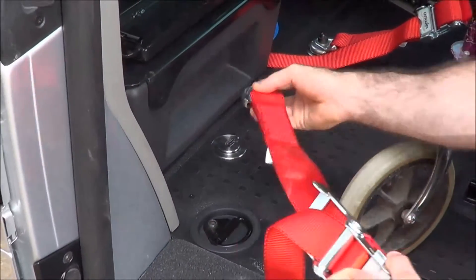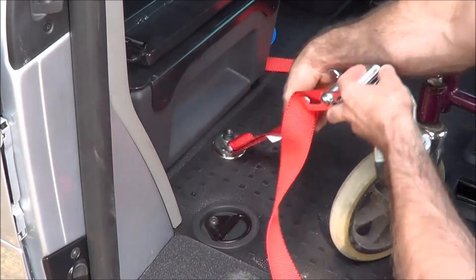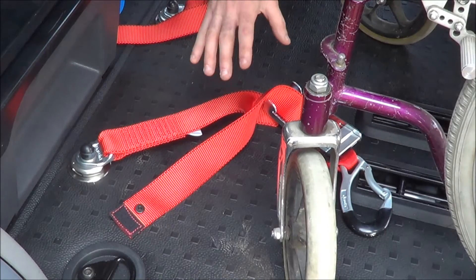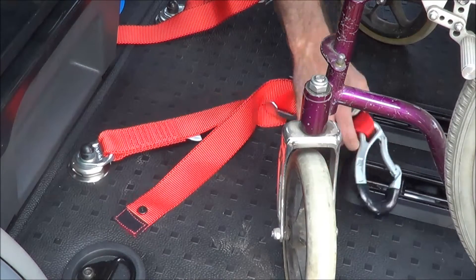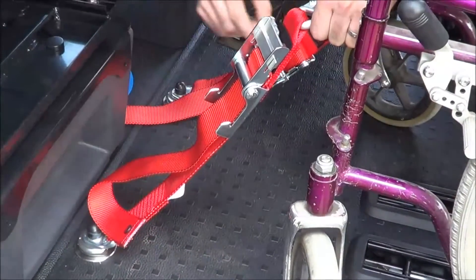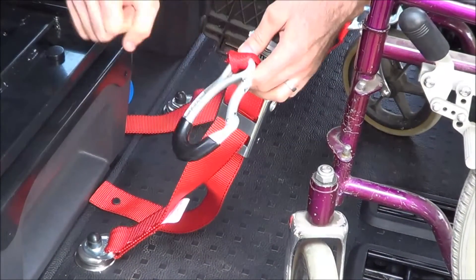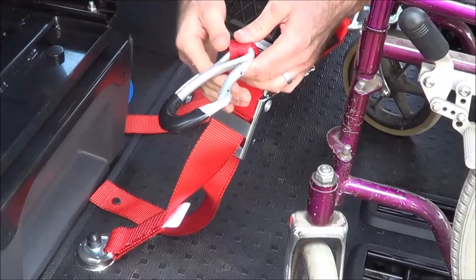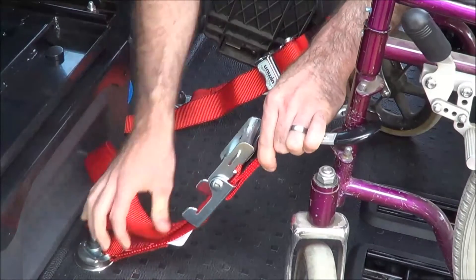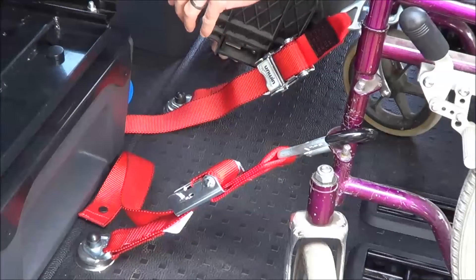The system simply connects in, and only connects in one way — from the side. We simply slide it onto the mount and then direct it towards the chair. The system is available with adjustable front straps or fixed front straps. They're also available with a carabiner style connection or a buckle and tongue, which is more like a seat belt design. Simply connect them to the front of the chair; if they're adjustable, just find the position and apply a slight tension first.